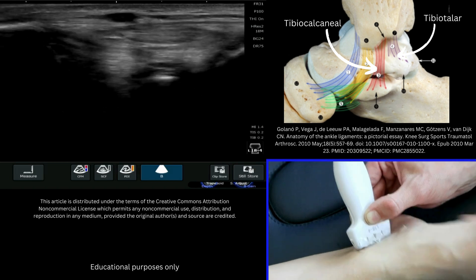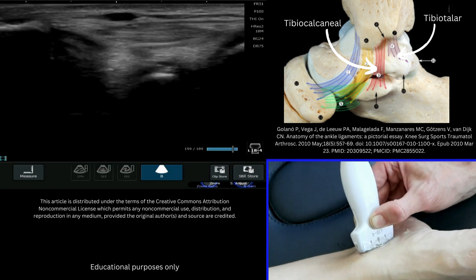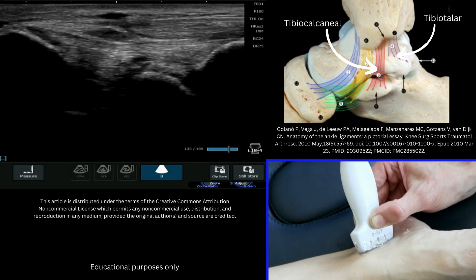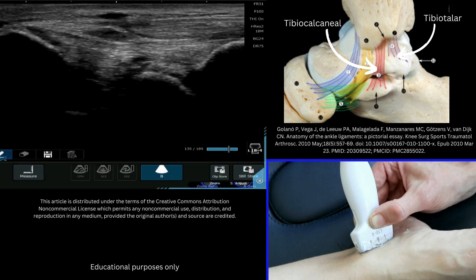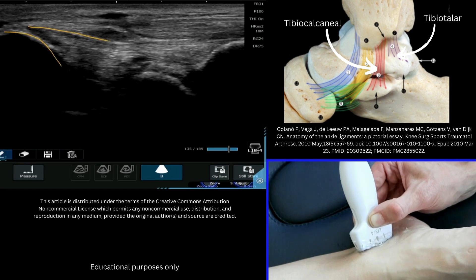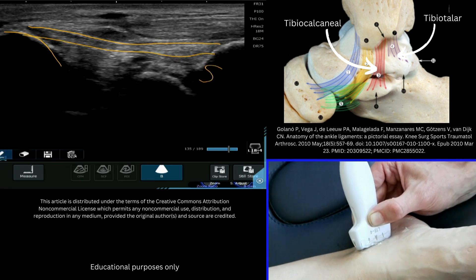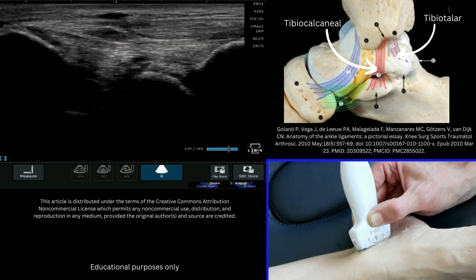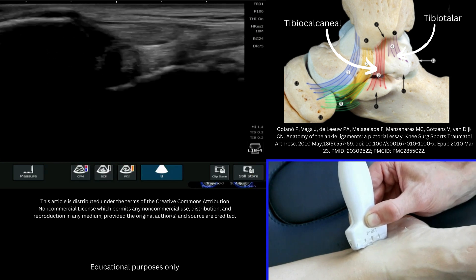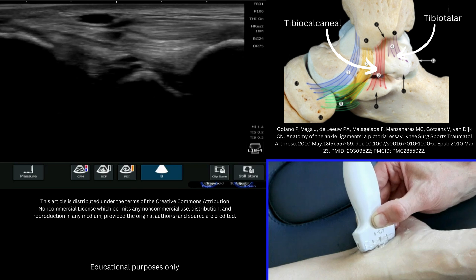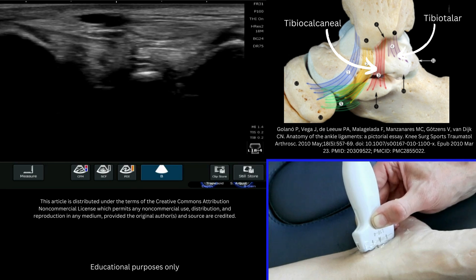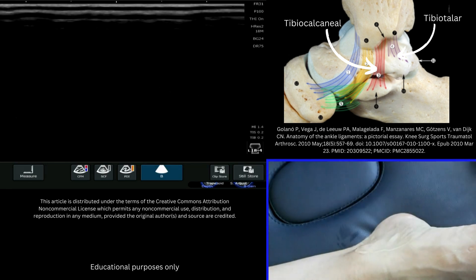If I freeze my image there, you can see this is the malleolus and here comes the tibiocalcaneal ligament over the top to the sustentaculum tali on this side of the image. And that is how you find your deltoid ligament.